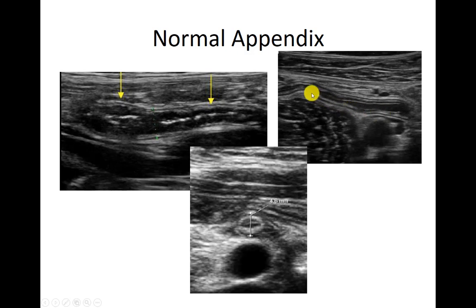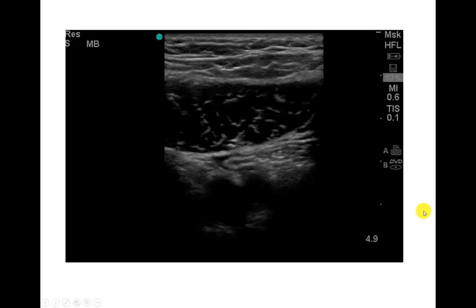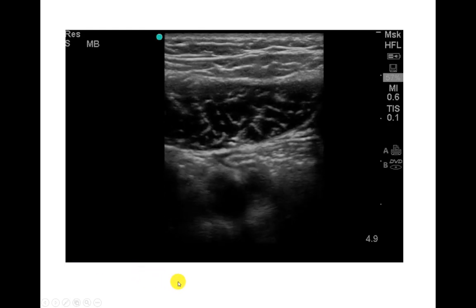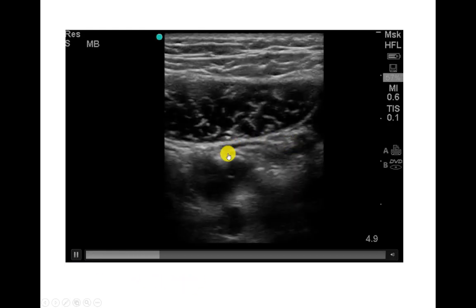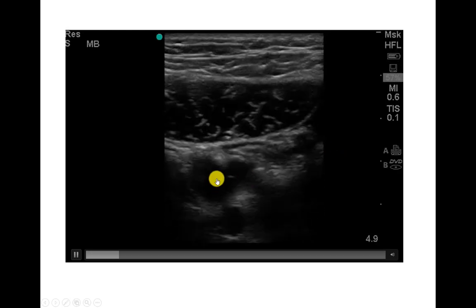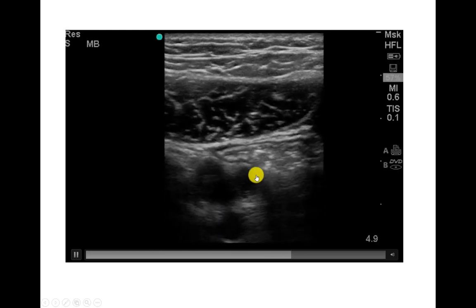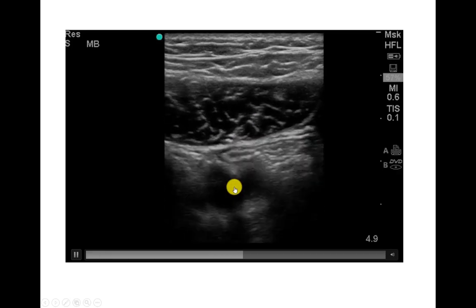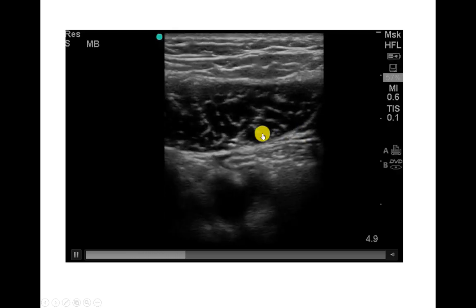The appendix often lives right around the iliac vessel and the psoas muscle. So sometimes people say look around the psoas muscle and the iliac vessels and the appendix should be somewhere around there. Here's a live action shot — this finger-like projection is the appendix. Here's the vessel, here's the abdominal wall. You can see the operator is trying to compress the structure, which is one of the things we do once we find the appendix.